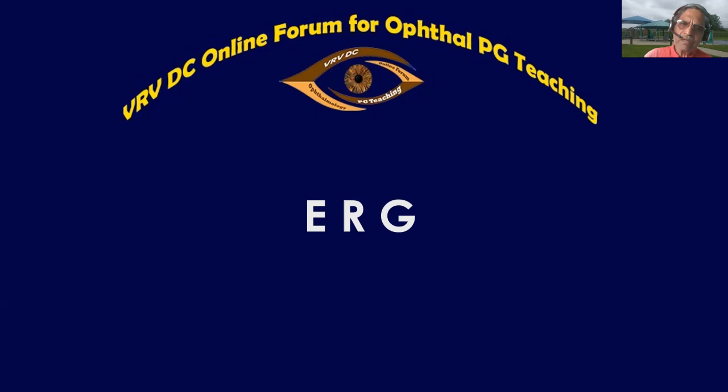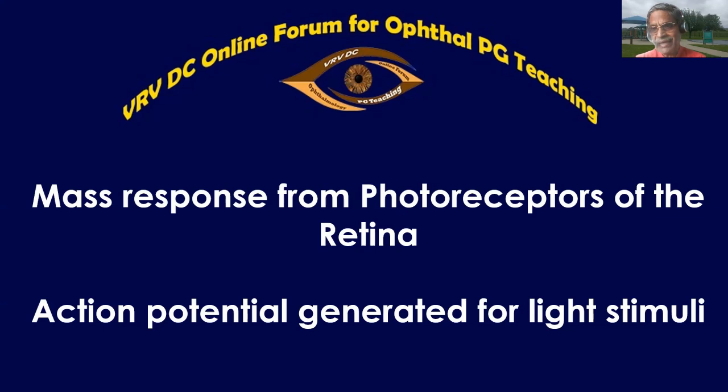Now, what is the ERG here? When the light is falling, whether dark adapted or light adapted, on any part of the retina, if it is functioning, it can generate the impulse. That's the most important thing. That's why, generally, it is not specific for a particular area in the retina. It's a mass response from the photoreceptors of the retina. Action potentials are generated for the light stimuli.